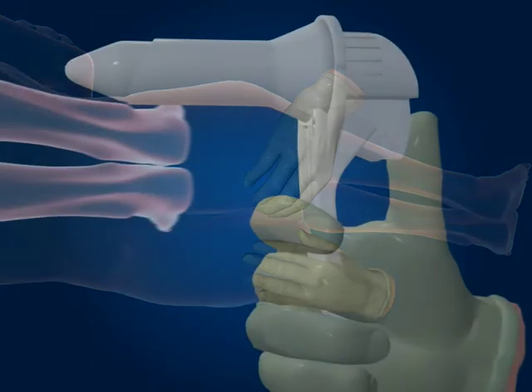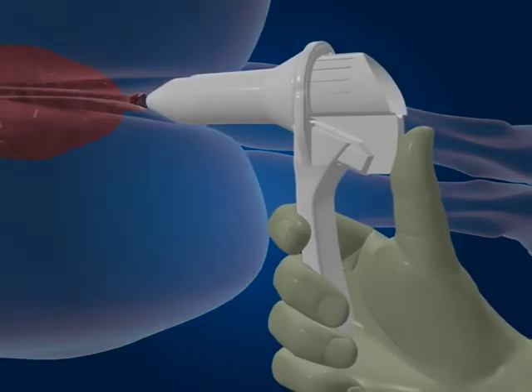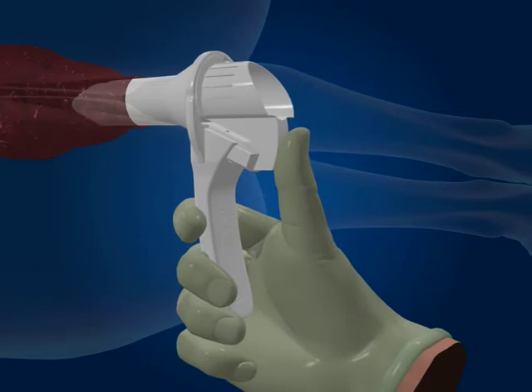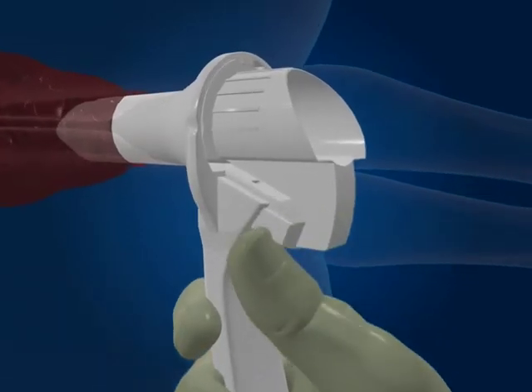Holding your thumb on the end of the obturator, gently insert the Cyclopes and advance into the desired use position. Ensure that no tissue becomes accidentally trapped.